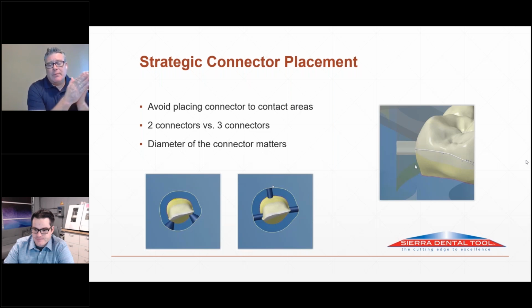You'll get undercuts from the milling tools, and then you have to spend a lot of time finishing out. Yeah, you'll end up with this huge triangle there, right? Yeah, I can talk about this for a long time because I've been doing it for so many years. A lot of grinding. A lot of grinding.